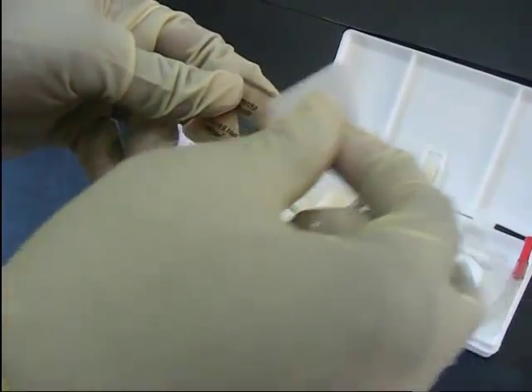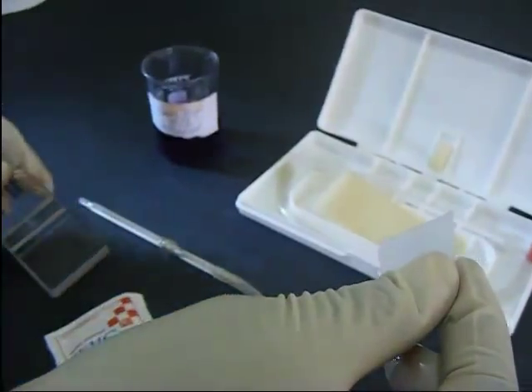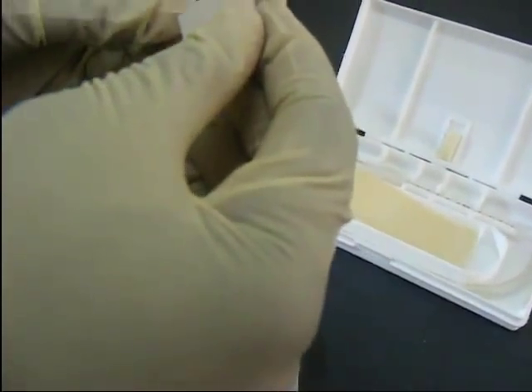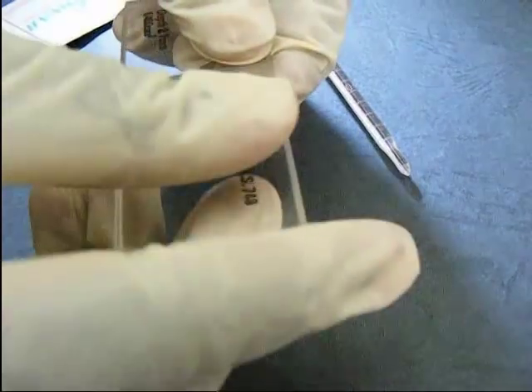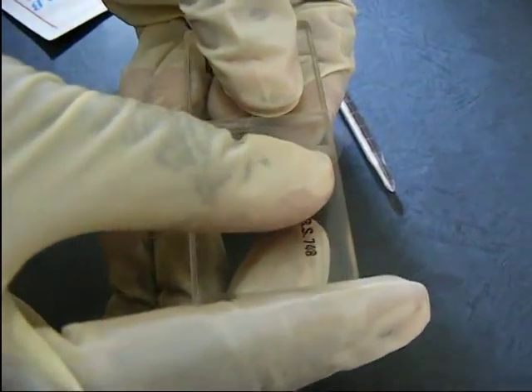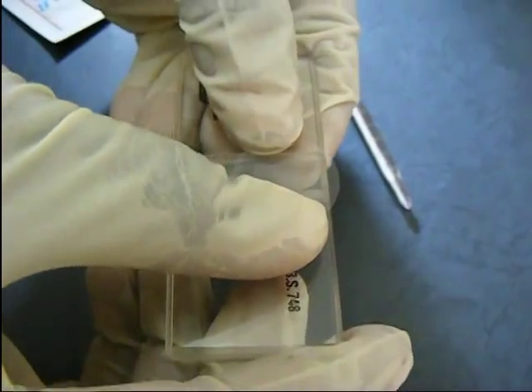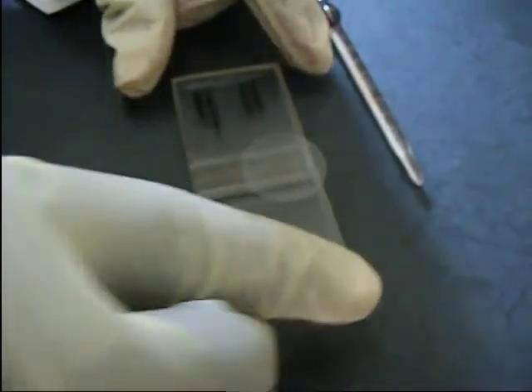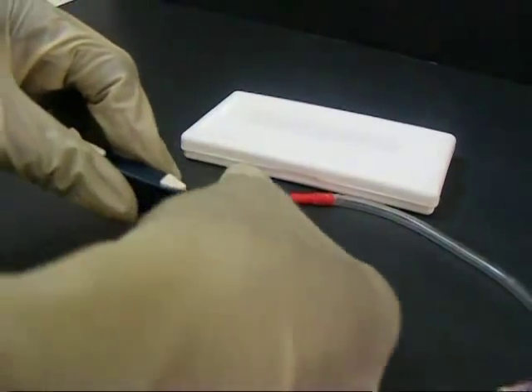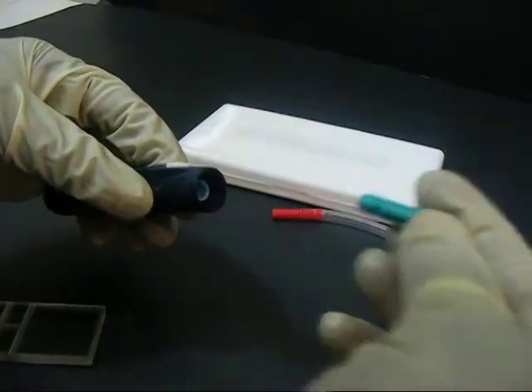The counting area and the cover slip are both wiped with a clean alcohol swab. The cover slip is placed firmly on the counting chamber. The lancet is then fixed on the lancet holder and made ready for use.